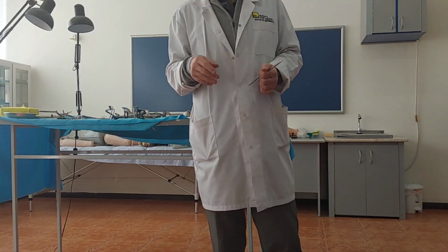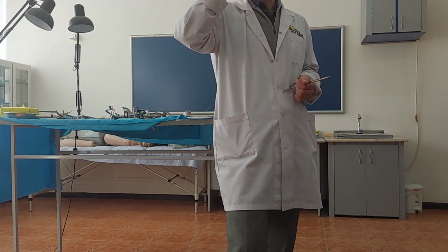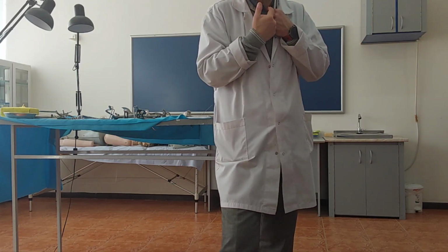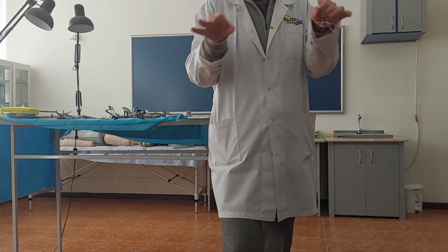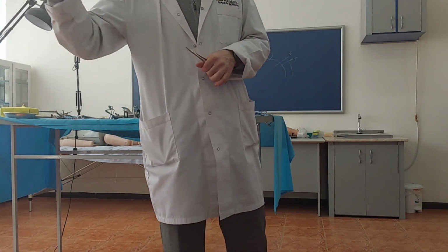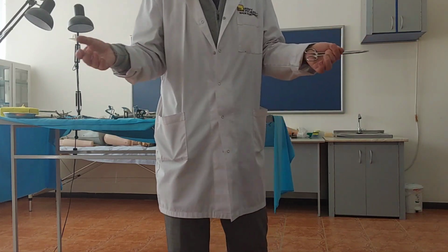We have two types of the staplers. If you will open, you will see in our slides, we have line type shaped stapler and round stapler. Of course, I think it's so simple to understand that round staplers we use to connect canal shaped structures to each other. Respiratory canals, gastrointestinal canals, vascular canals. It's simple.